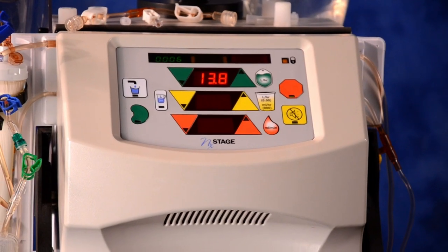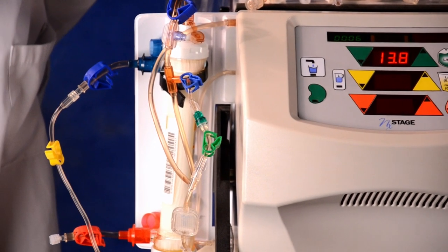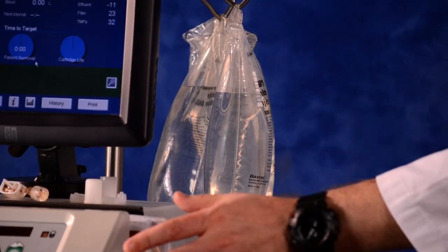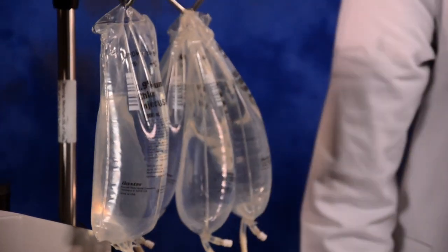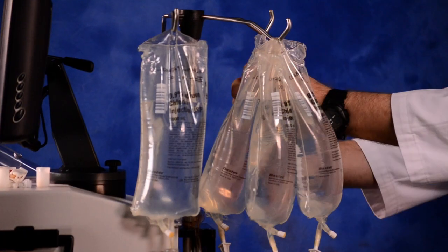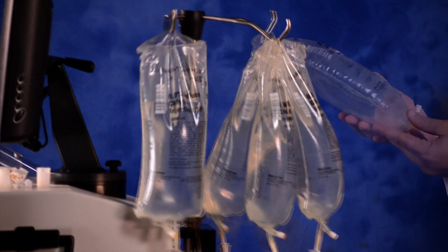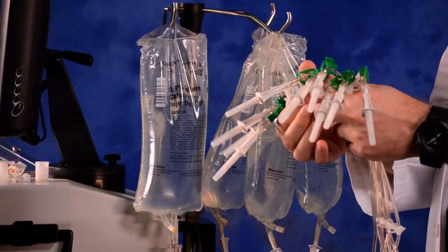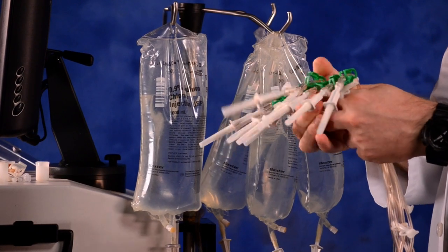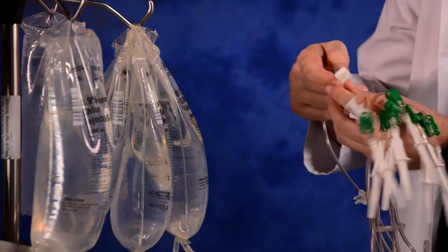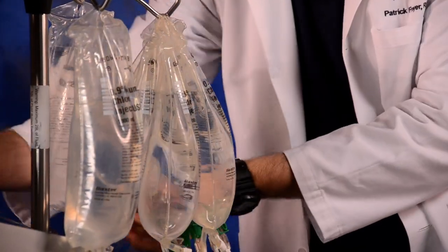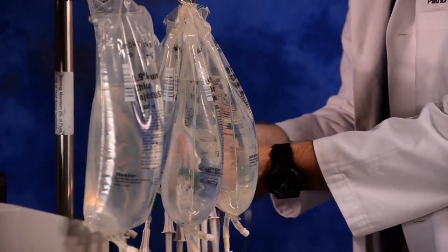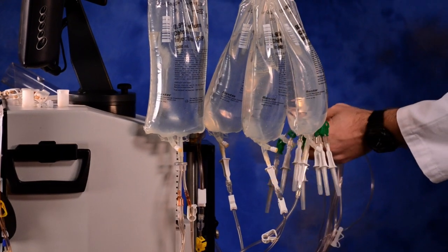While waiting for prime and alarms test to continue, hang the therapy fluid, albumin or donor plasma, ordered by the physician on the IV pole. We are using normal saline for this demonstration. Clamp all the green end clamps on the therapy fluid MLA and connect to the therapy fluid. Prime the therapy MLA and clamp. Do not place into the fluid warmer. We will not be using the optional fluid warmer for this therapy.